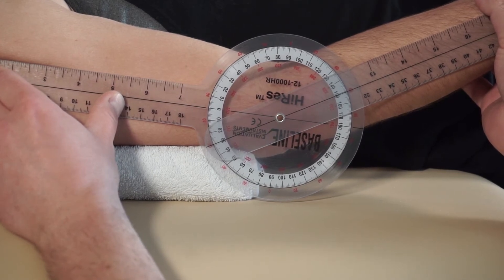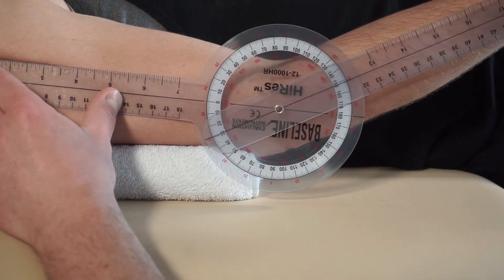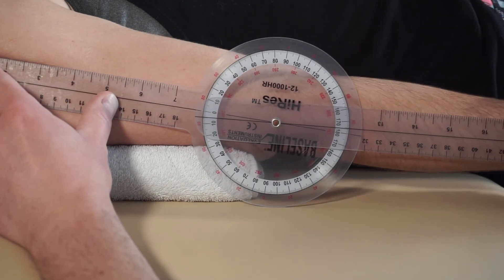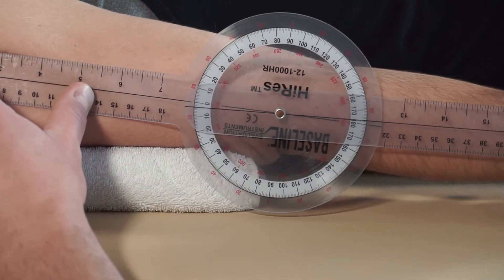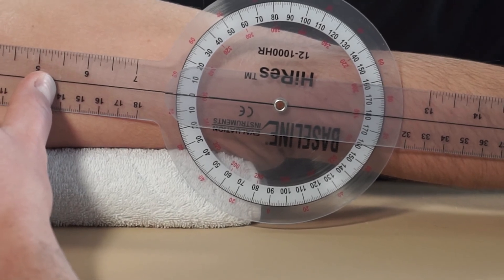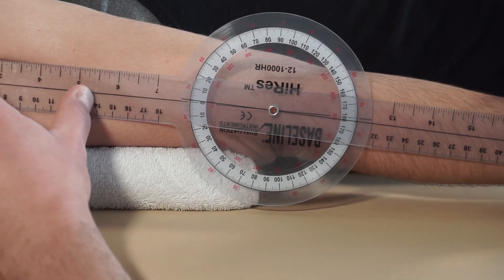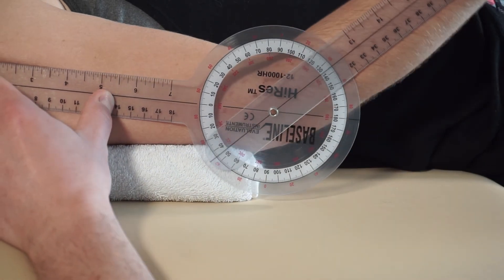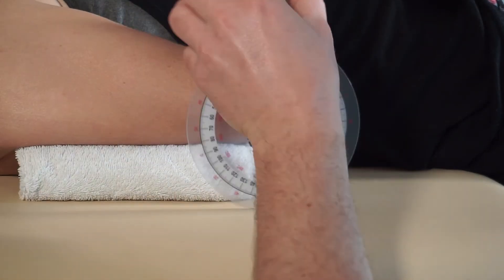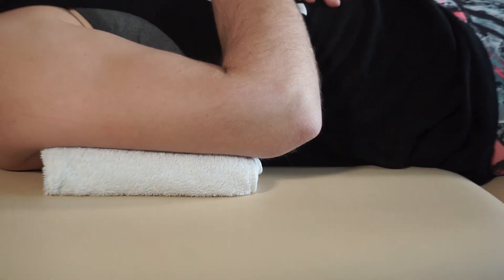We know that's not good because we can see it, and the end-feel is incorrect — it's firm, not hard. So now she's going to go ahead and do her regular range of motion. Go ahead and extend as much as you can. We line it up and she's right at zero degrees of extension. I'm going to apply a little force and find that hard end-feel — right there. She's at two degrees of hyperextension passively. Those are your goniometric measurements for the elbow.